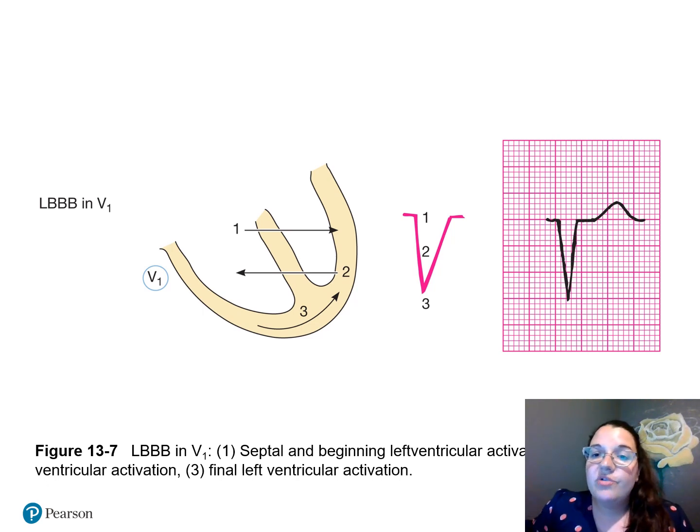All right, this is just showing you in perspective. Again, look, my T wave is opposite of my QS. So right bundle branch block in V1, we're going to have R prime, and our T is going to be opposite of our QRS. If it's a left bundle branch block, we're going to look at V1. We're going to have a QS or an RS.